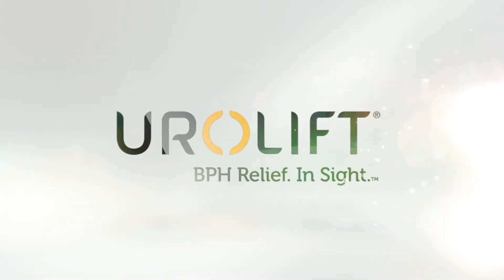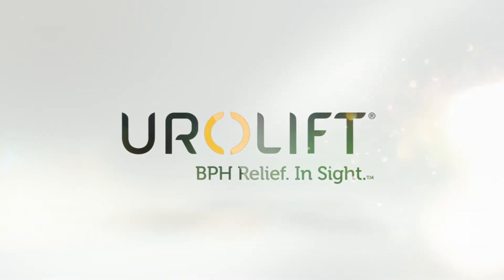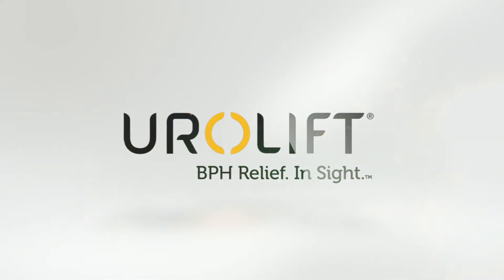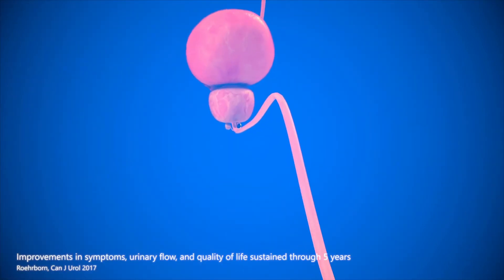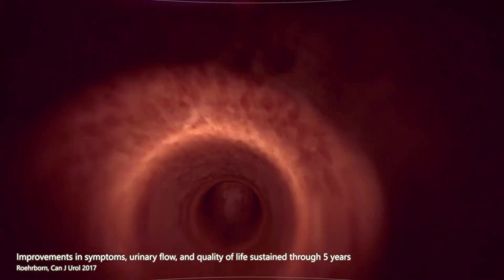The UroLift system is a proven, minimally invasive procedure designed to treat men with an enlarged prostate caused by benign prostatic hyperplasia, or BPH. It has been shown to relieve urinary symptoms and improve quality of life, with minimal side effects.